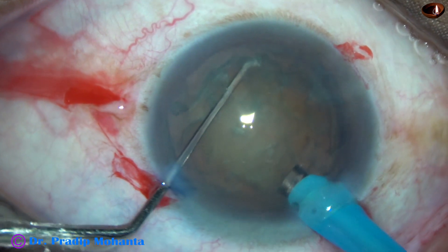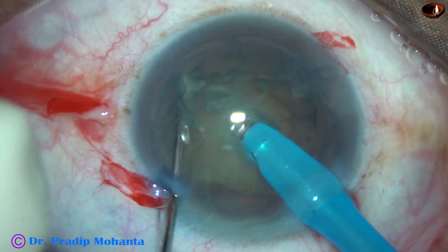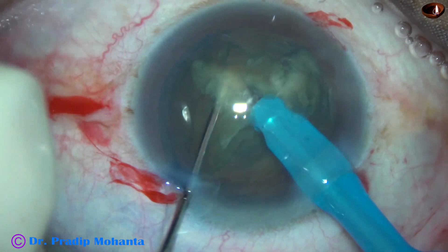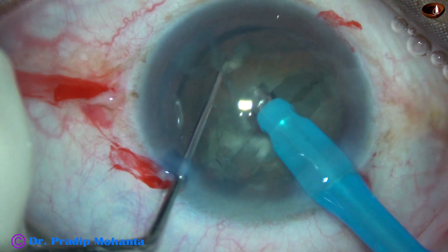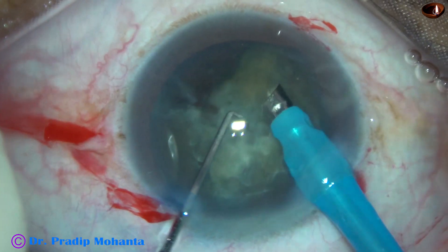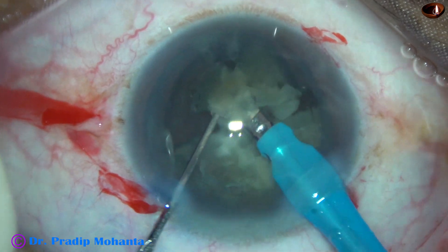Here it is. Just bury the tip into the substance of the nucleus, hold it at the center and slice the nucleus like this. Turn it, hold it at another place and slice. Thus one hemi-nucleus has been divided into two fragments. This is the other hemi-nucleus and the nucleus has been divided into four pieces. Now, this is real-time surgery — you can easily comprehend how much time you save by direct chop.